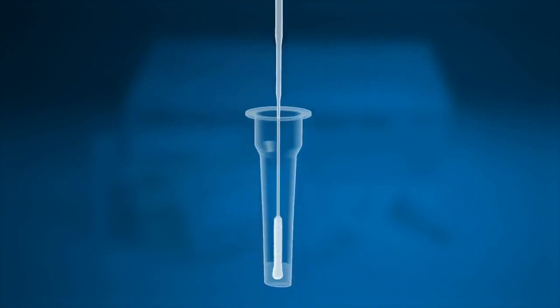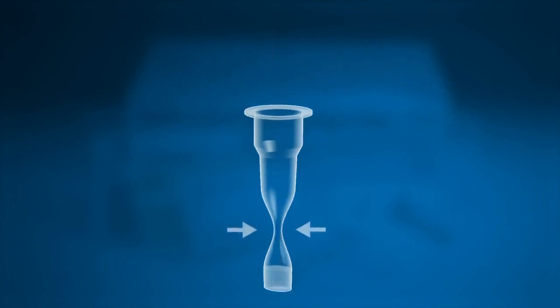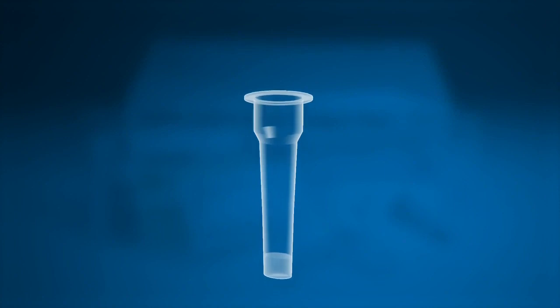Place the swab into an extraction buffer tube. While squeezing the buffer tube, stir the swab more than five times. Remove the swab while squeezing the sides of the tube to extract the liquid from the swab. Now press the nozzle cap tightly onto the tube.